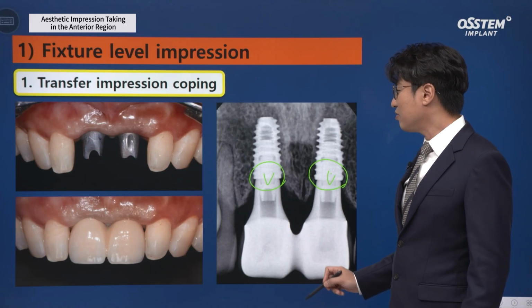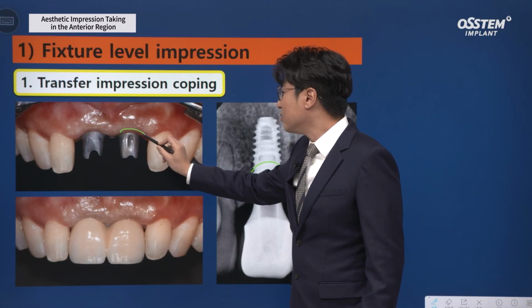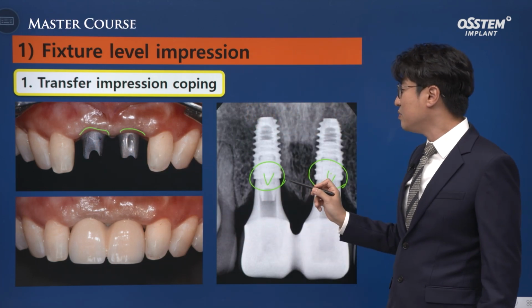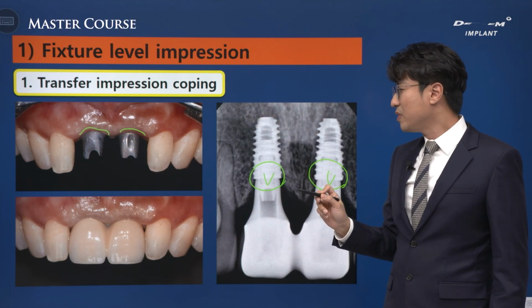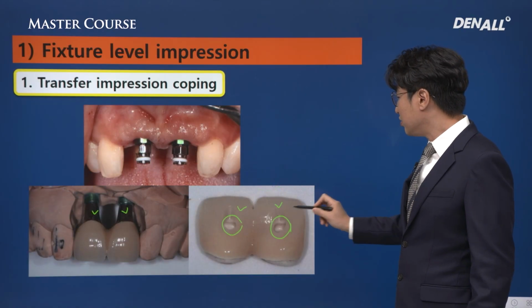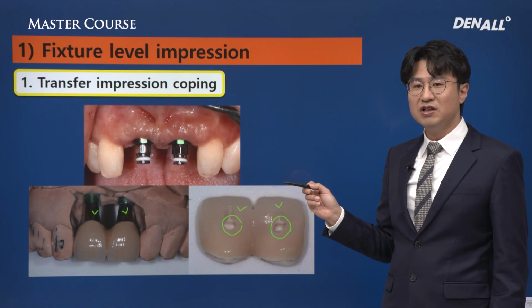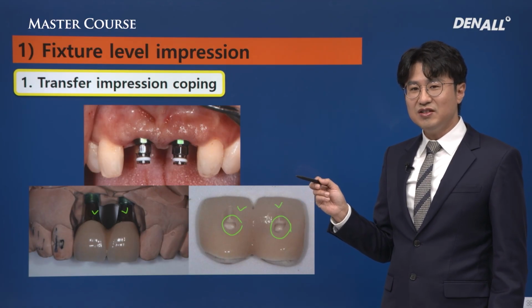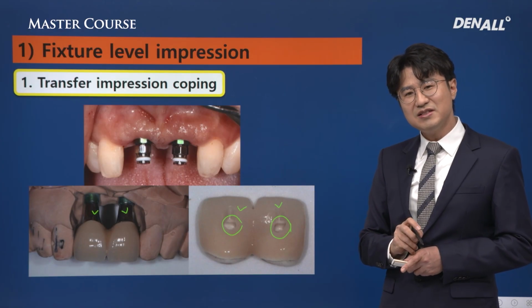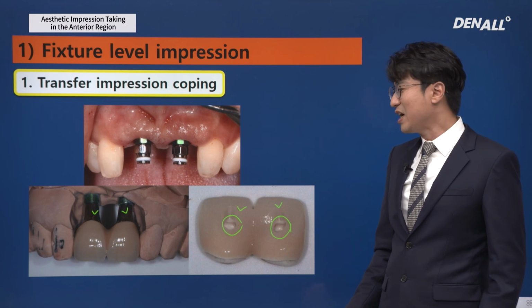For multiple restorations and to succeed with a stable prosthesis, we need to use a supramargin on the palatal side as much as possible. The subgingival margin should be 0.5 to 1 millimeter, not too deep, before cementation. As you saw before, the screws are removed using the screw holes to remove the cement. Even though we are very careful during cementation, subgingival margin cement removal is very difficult.